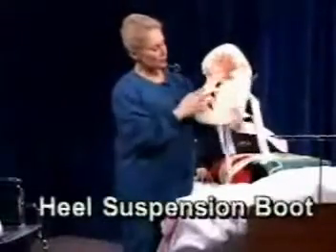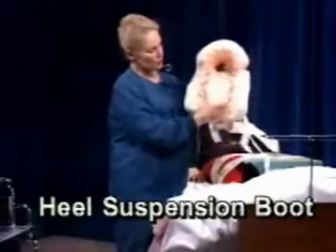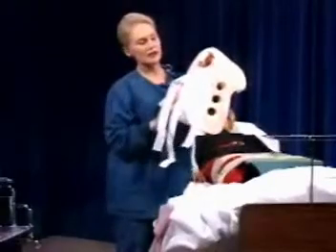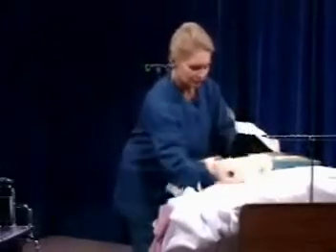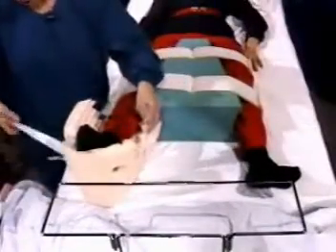It's composed of a complete foam rubber exterior. There's a little supportive pad in here that's adhered to with Velcro, and there's a hole in the boot where the heel is actually suspended and kept off of the mattress. I'm going to put this on our patient. It's actually very comfortable, patients have told me. And this too is held on with a series of Velcro straps.